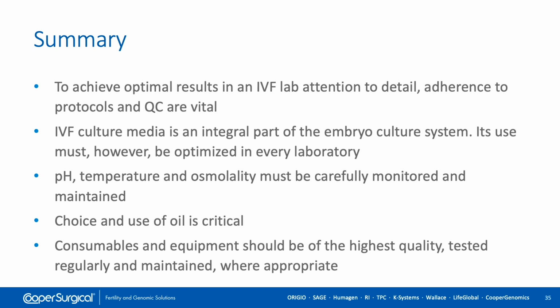We need to control and monitor pH, temperature and osmolality as much as possible, and this needs to be monitored and maintained in a narrow range to give the least amount of stress to embryos as possible, again to give them the best chance of reaching a healthy normal stage prior to transfer. The choice and the use of oil is critical. We've discussed dish making, and the dishes need to be made in the right way, one at a time, using the correct technique and the right amount of oil.